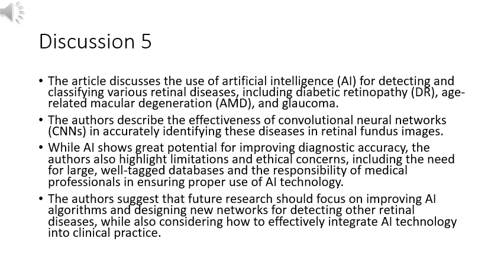In our opinion, this problem could be solved with bigger datasets that include rare diseases. In the end, the more we teach the AI system, the more it learns. Meanwhile, AI could be used to ameliorate the cost-effectiveness of using hybrid systems supervised by a medical expert, raising doctors' performance beyond unaided human-only abilities.